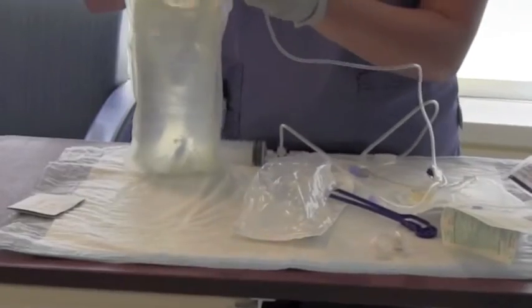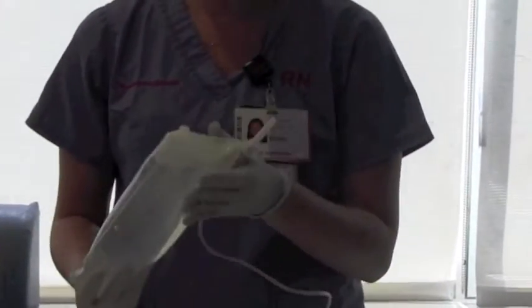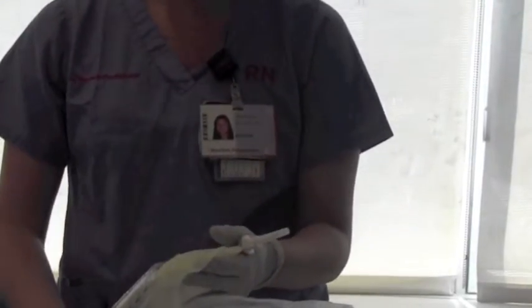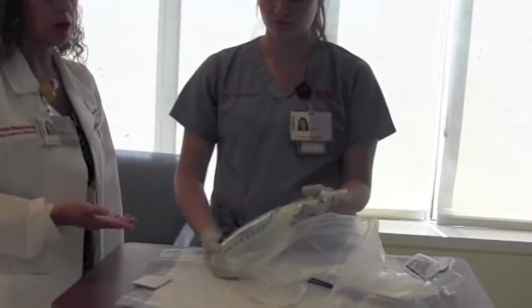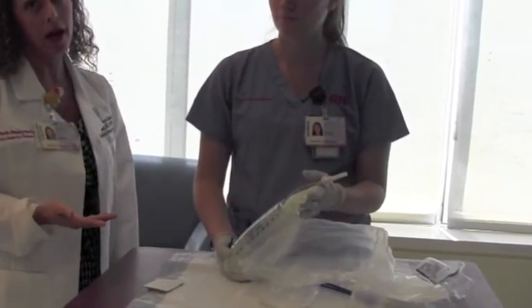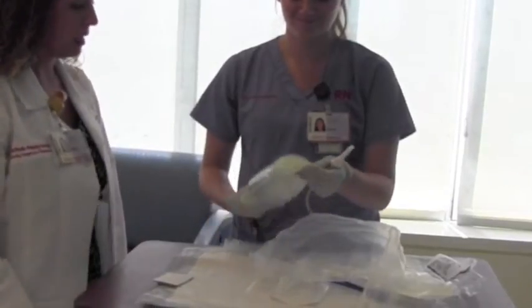And then what we're going to do is spike the isotonic IV fluids. It can be a liter bag, or it can be a 500 cc bag of sodium chloride or lactated ringers, and you have to do a 2-RN check because that's part of the policy anytime you're giving a fluid bolus to a patient. So yep, that's normal saline, a liter.